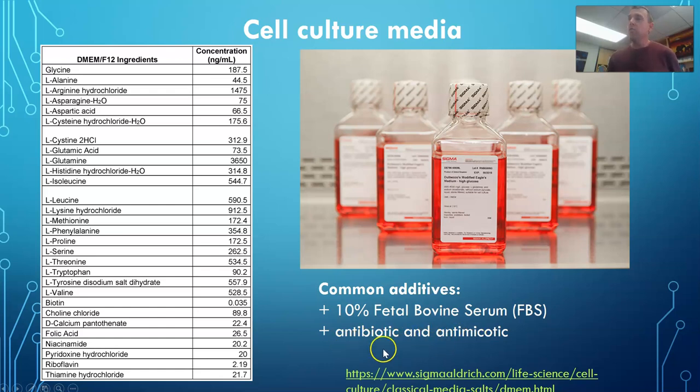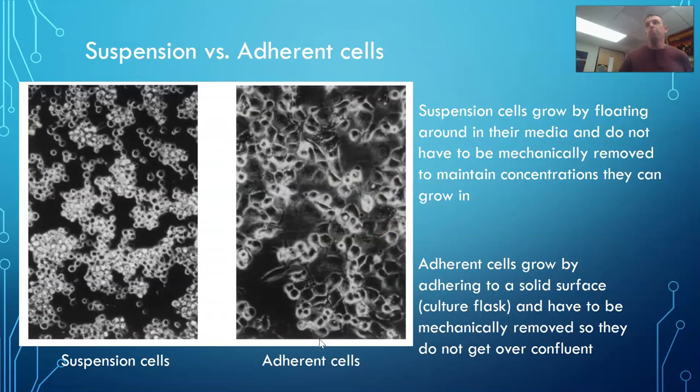This is just a way to really hedge our bets against bacterial or fungal infection. Although even with that antibiotic and antimycotic, we still, as I'm going to tell you, have to be extremely careful to make sure we maintain sterile conditions and don't let those things get into our cultures.